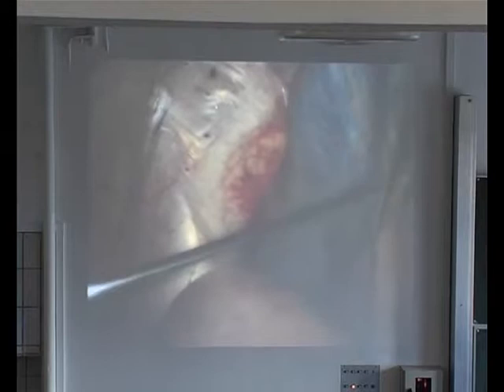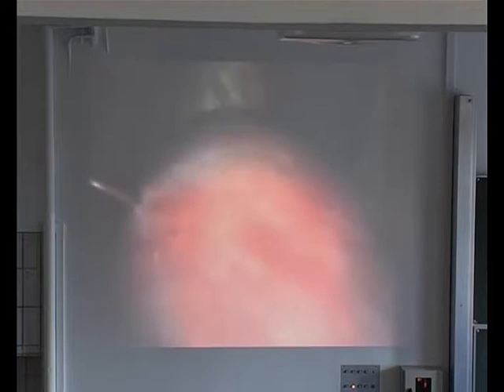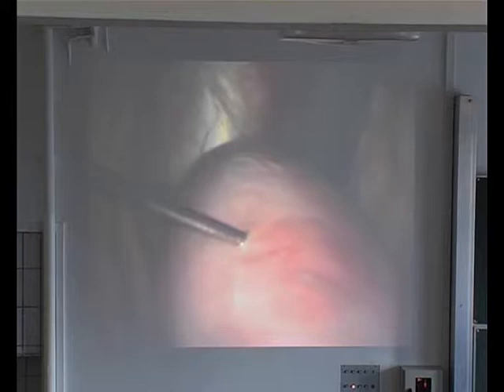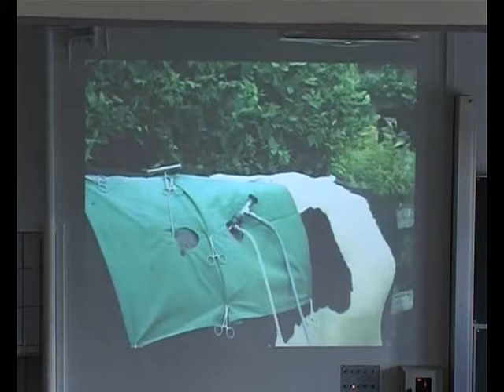And now you see this part of the abomasum covered by the omentum with its vessels, and here the beginning of a gray surface, and this part at the top of the abomasum is a correct position to fix the abomasum, to bring the toggle into the lumen of the abomasum. And first we bring in the toggle, and then we slowly release the gas completely.